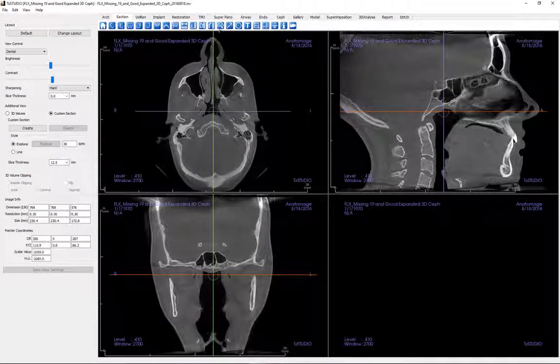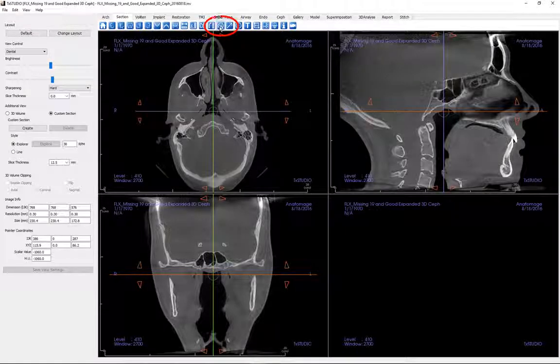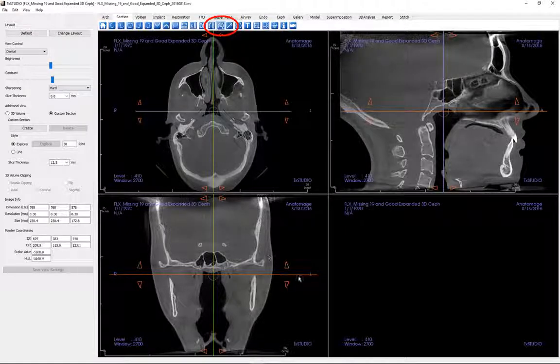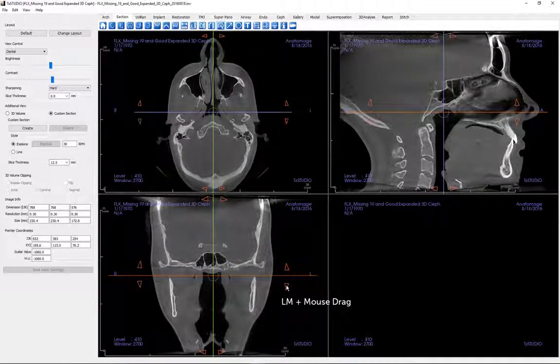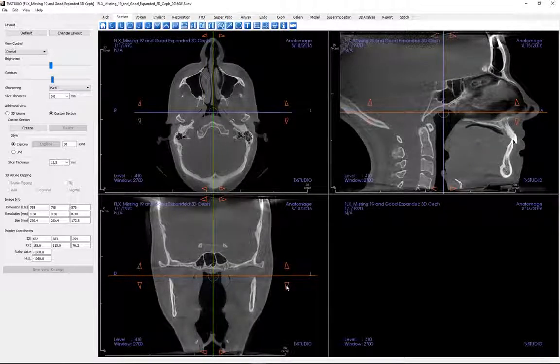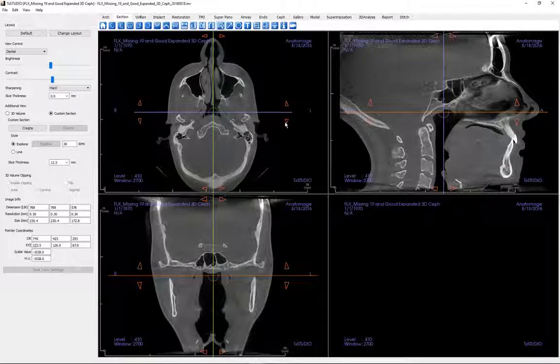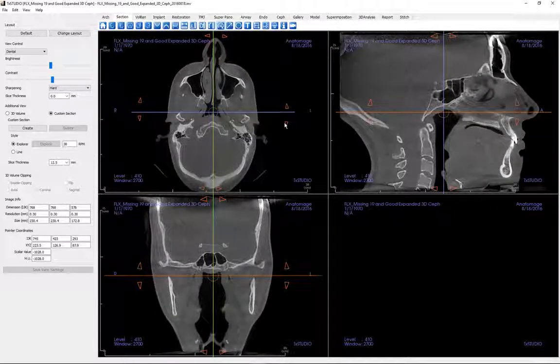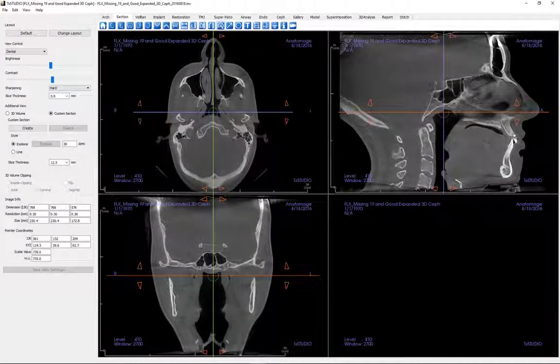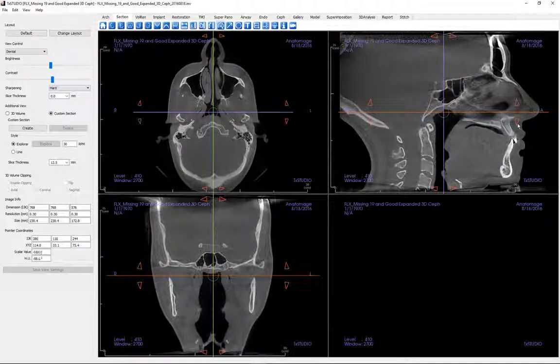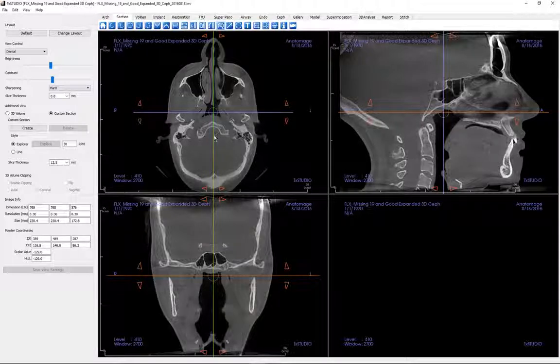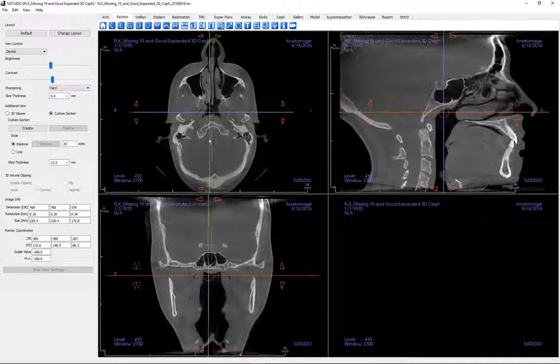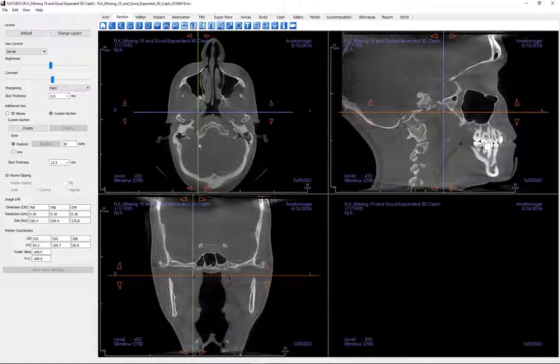Let's click on the reorientation icon to activate it, then click on an arrow and while keeping the button depressed, drag the mouse to achieve the desired orientation. Ideally, there would be no side-to-side tilt and the occlusal plane would be parallel. After changes are made, click on the reorientation icon again to lock in the changes.